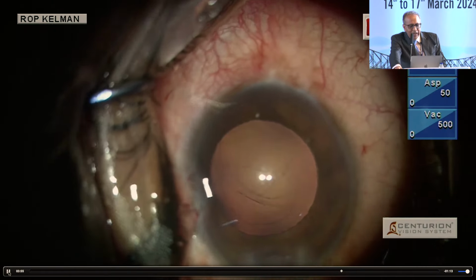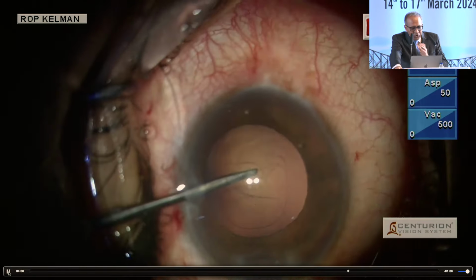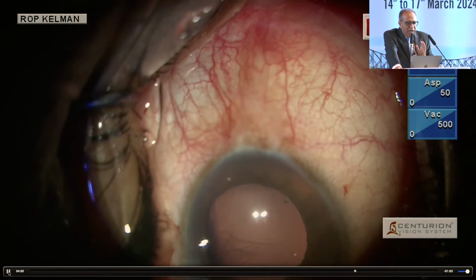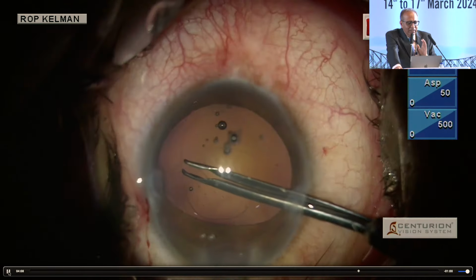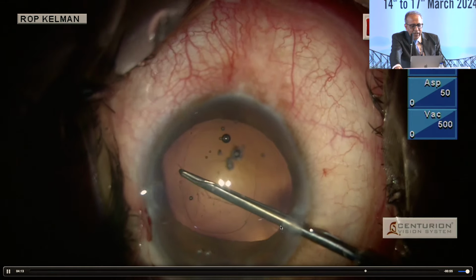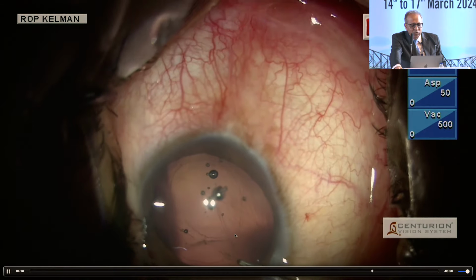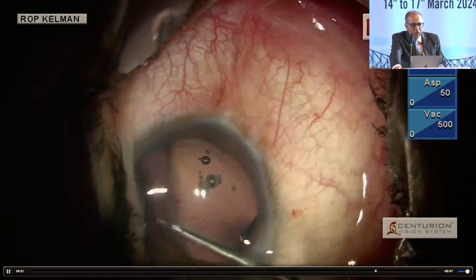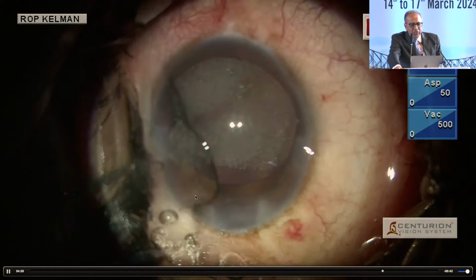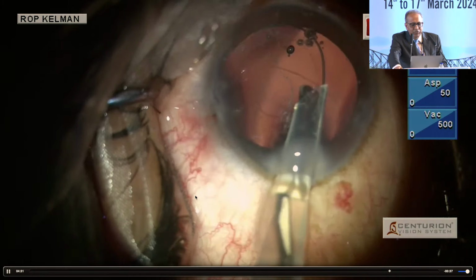Once again I inflate slightly and push it back, and now I've been able to round off this capsular tag and made it a sort of posterior capsulorhexis. Now I am going through the other incision which I have created with Haldipurkar's capsulorhexis forceps, and I've been able to round it off. I was not confident, so now the triamcinolone is being used, and you will find that there is no disturbance of the anterior hyaloid face.